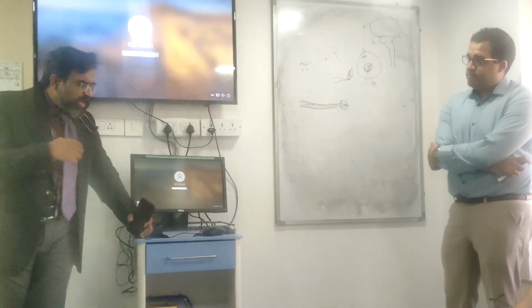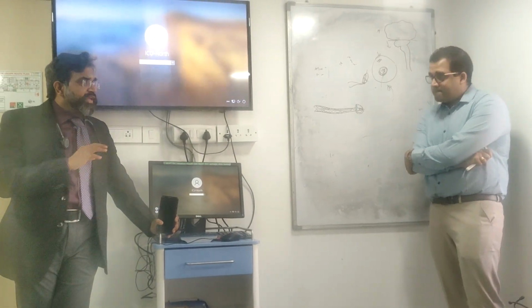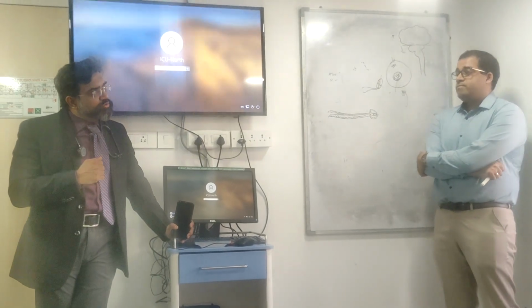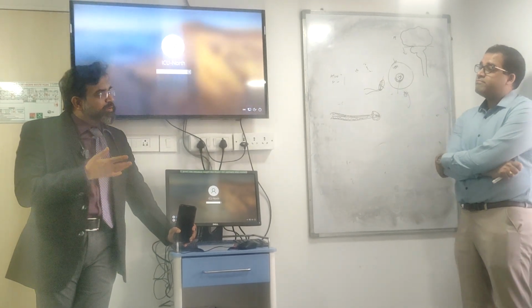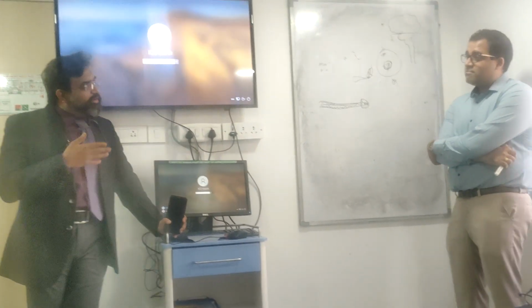So one question I had in my mind was this: when you have pediatric sepsis, we give 3 ml of blood, isn't it? So why don't we use 3 ml for adults also? The question is, if pediatric sepsis is getting picked up with 3 ml of blood, why don't we send 3 ml for adults also?